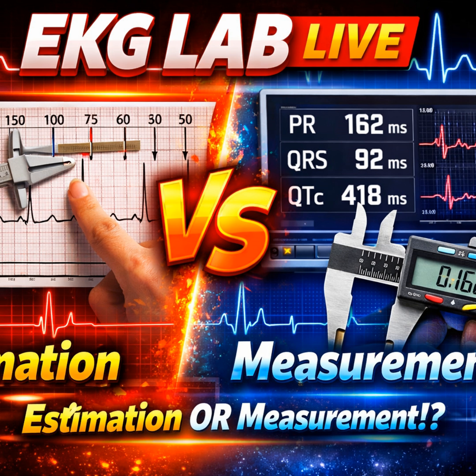I disagree strongly. Rate, rhythm, axis, intervals, P's and Q's. Every single time. This prevents you from being distracted by the obvious S1Q3T3 and missing a secondary block or subtle ischemia elsewhere. You see the PE pattern and stop looking. I finish the checklist and find the rest. In a desk review, absolutely. Use the uniform approach. But we are talking about the showdown between grit and gut in the trenches.